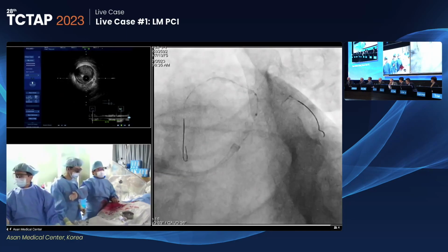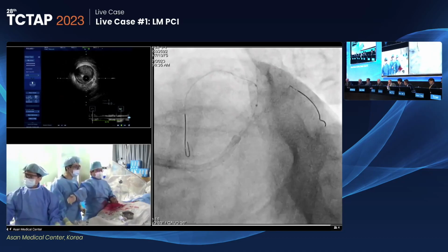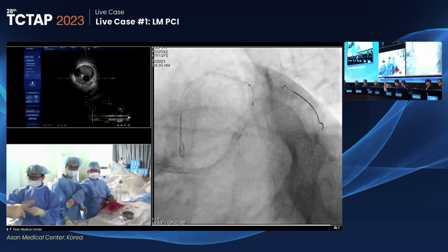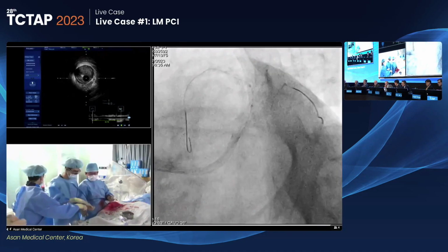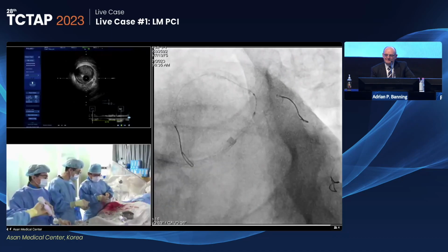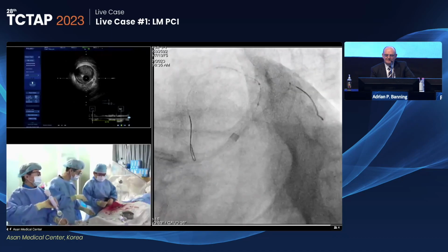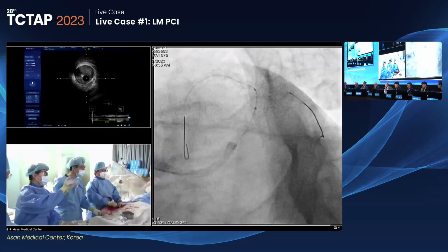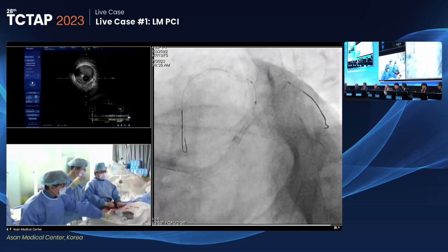It would still be possible to do a provisional approach, left main to LAD, and leave the balloon result in the other two vessels. But as soon as the next stent goes in, there's a lot more stent going in. I think, given the sections that are there, you're committed to the multi-stent approach up front now. Well, I'm not sure that's true.